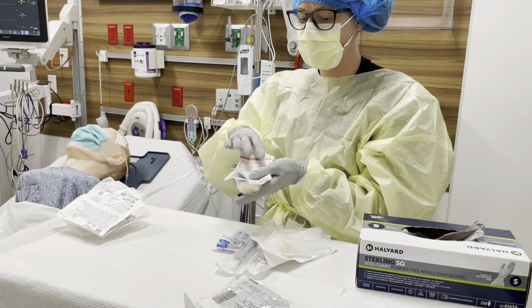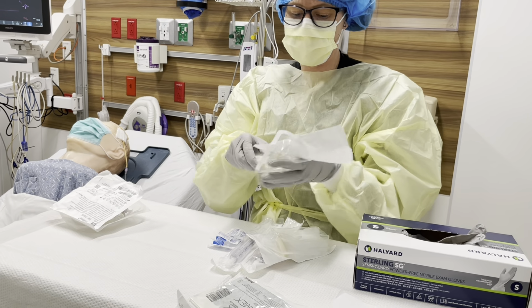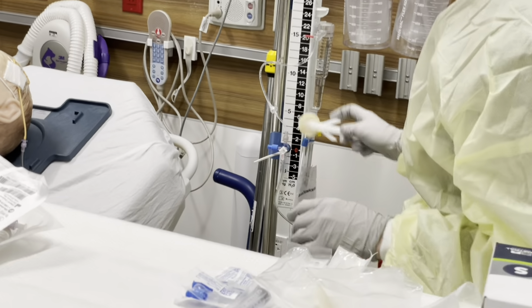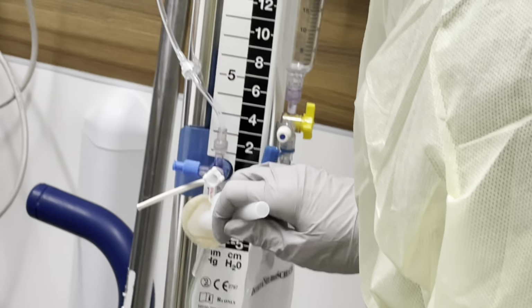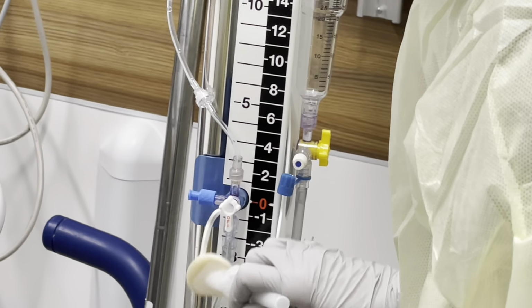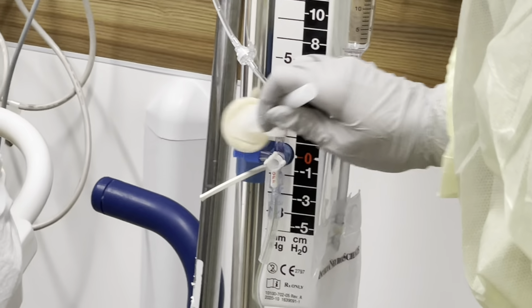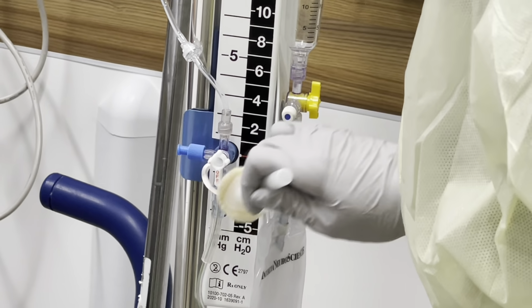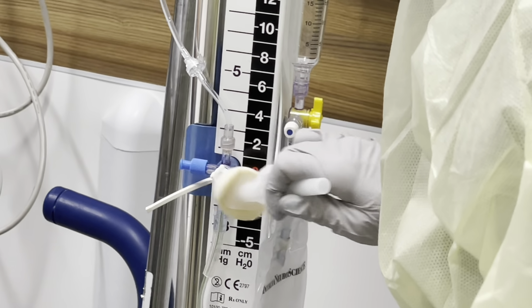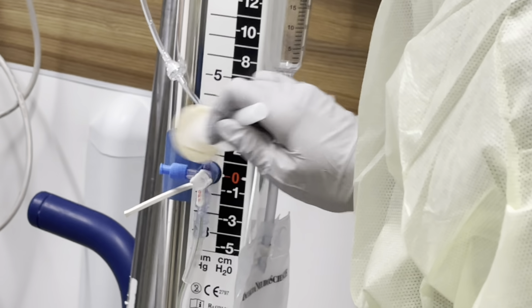So again, we're gonna open this, you know, pop. Make sure that you got it nice and moist in there. And then you're gonna clean all around here. You're gonna make sure that everything is nice and clean, because you're not trying to have any kind of bacteria anywhere around the site. A lot of times, when we're coming out of OR, we're gonna touch things. It's gonna be in the bed, all kinds of stuff. So we're just gonna make sure all of this is as clean as it can possibly get. Okay, once we know that that's been nice and clean, good 30, 45 seconds, we're gonna let it sit in air.